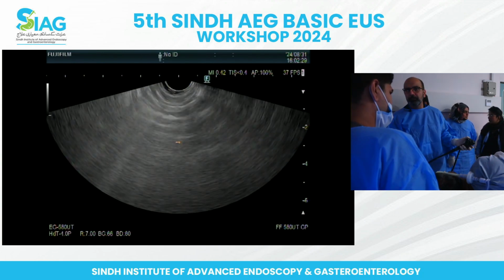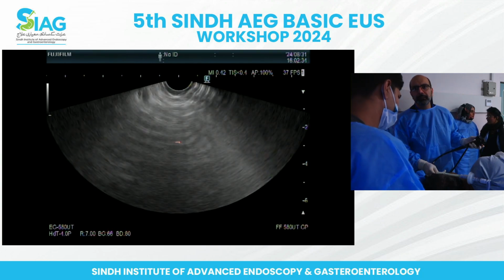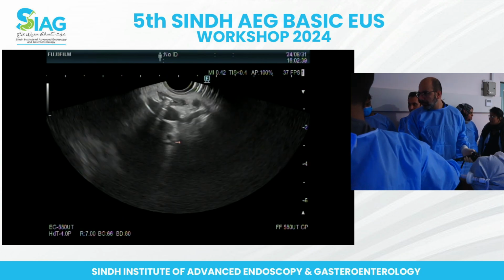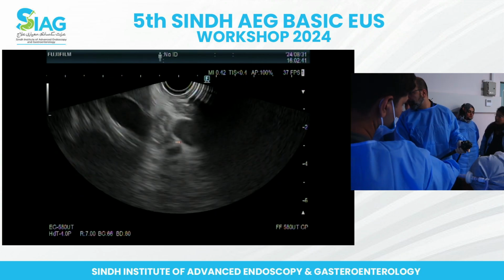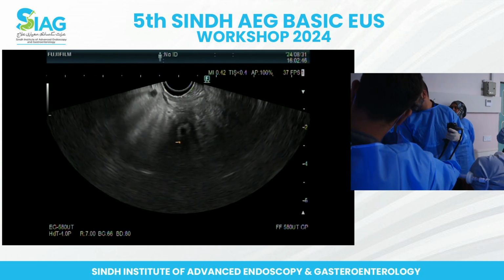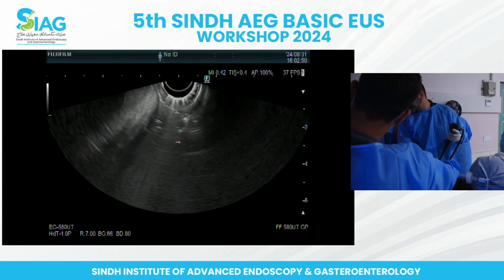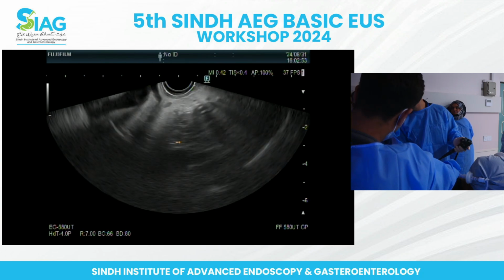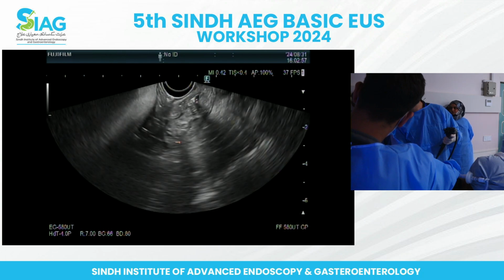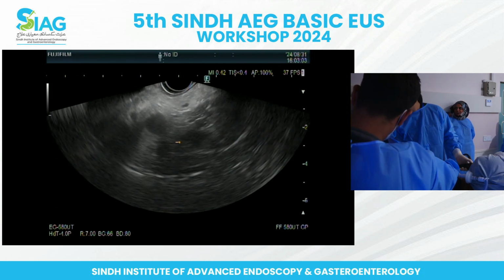Also, I think the view that we saw it best from was the bulb. So I might try that. So there's my bile duct, following it down. There's the pancreatic duct. Lymph nodes.